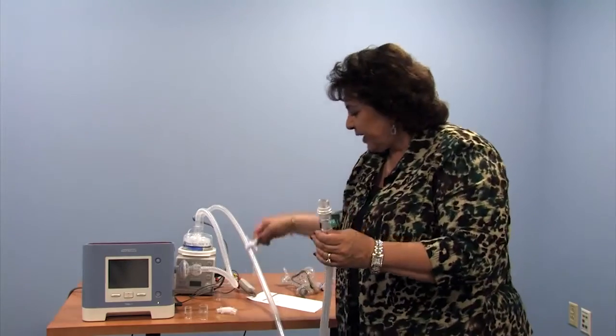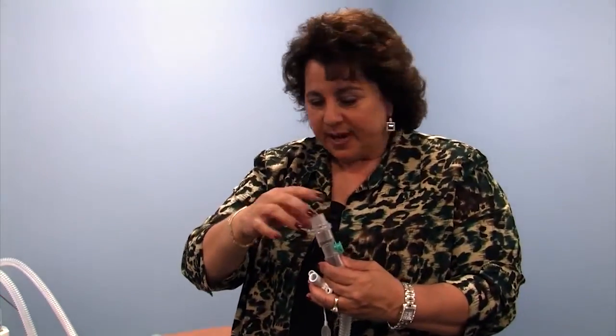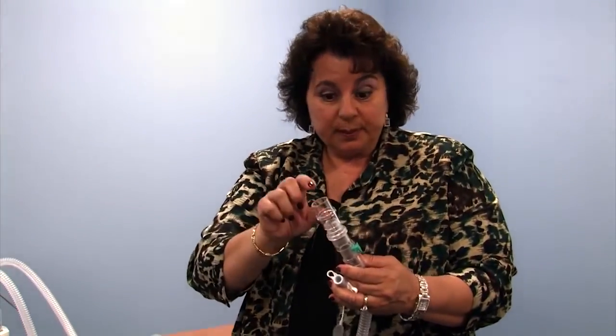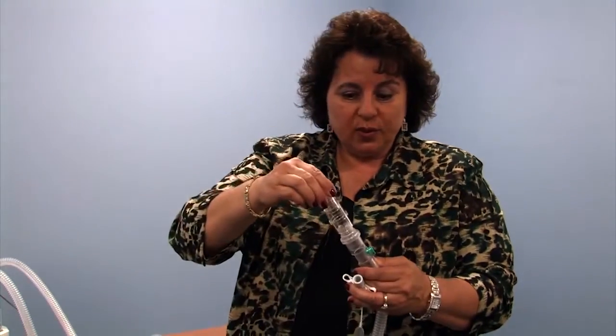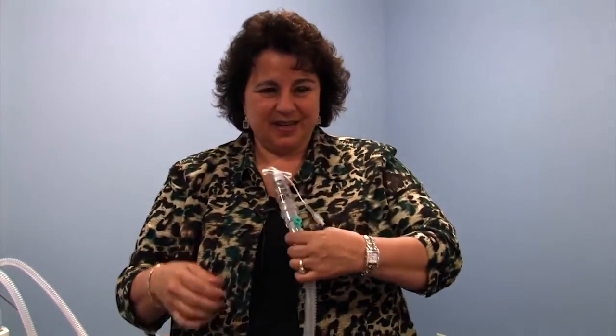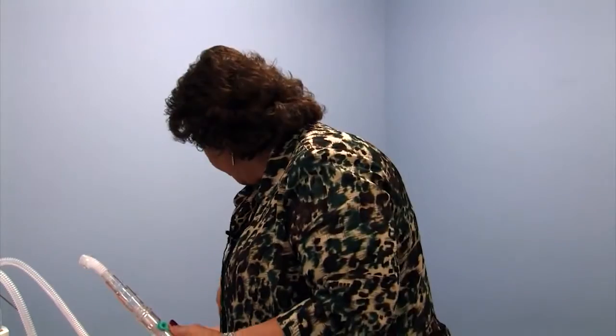When a patient is being connected to a tracheostomy tube, they don't have the extra places for the air to come out. So they need this whisper swivel or exhalation port in the circuit as close to the tracheostomy tube as possible for when they exhale. Unfortunately, the way the tubing is made, we do need some adapters. So we have an adapter typically known as 22 millimeter for the size of it, and then we take it down to what's known as a 15, and then it will fit directly onto the tracheostomy tube. Now this might be a little cumbersome and stiff, so we are allowing folks to use, for the younger population, the smaller swivel, and then we do have the larger swivel as well that I showed you earlier, for flexibility.